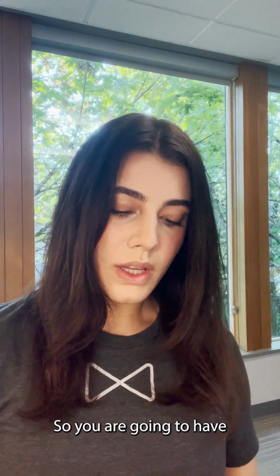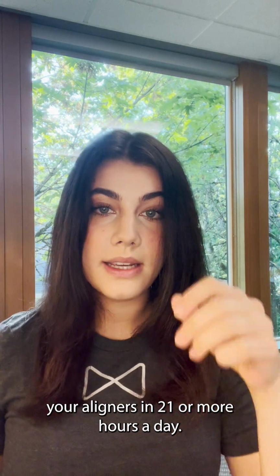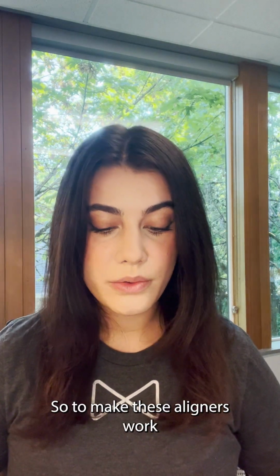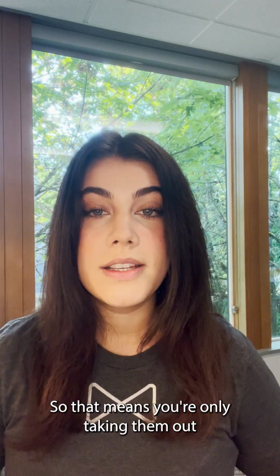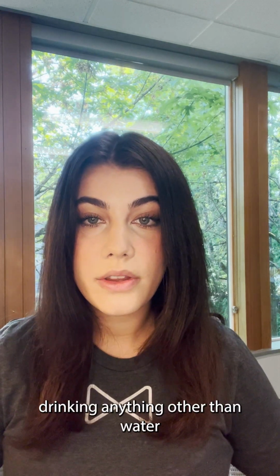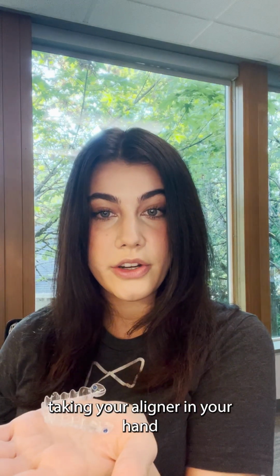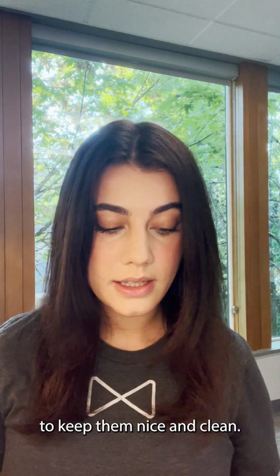So you are going to have your aligners in 21 or more hours a day. That's really important because what makes braces work so well is they're putting constant pressure on your teeth. So to make these aligners work just as well, we need those 21 or more hours. So that means you're only taking them out when you're eating, drinking anything other than water, or brushing your teeth. And when you are brushing your teeth, something that can be helpful is just taking your aligner in your hand and brushing them as well with your toothbrush and toothpaste to keep them nice and clean.